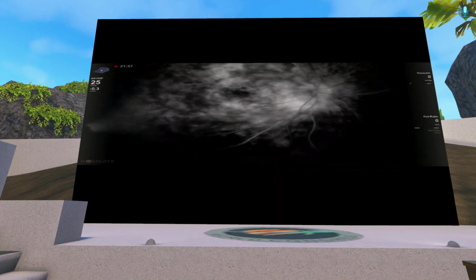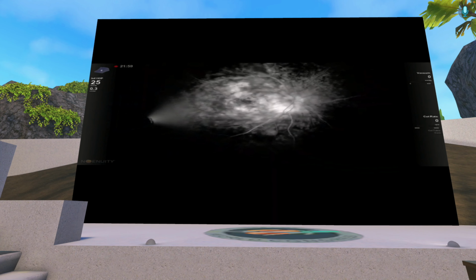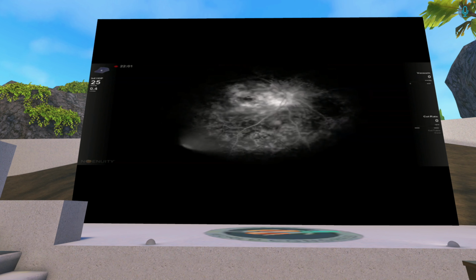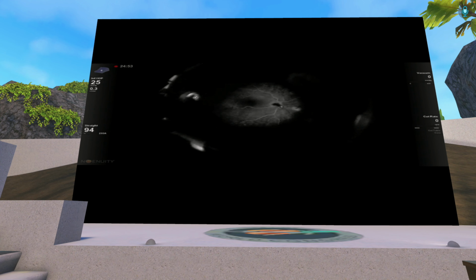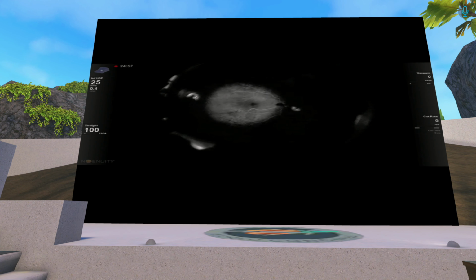So probably if I need to make it in percentage, 30% will be for the endo illumination and 70% will be for the digital filter. And also probably the quality of the microscope, because I found that different microscopes, I don't want to name them, but some of them are inferior in terms of image clarity and contrast compared to others.